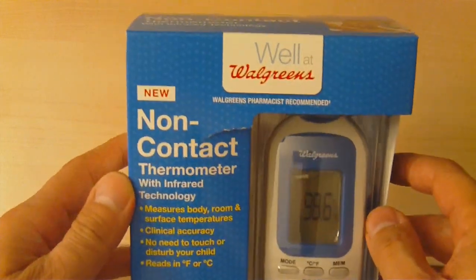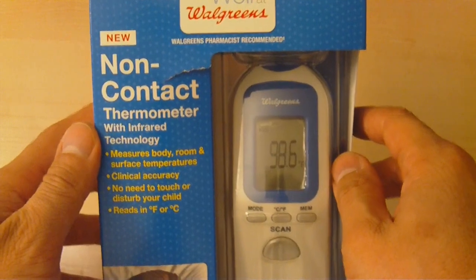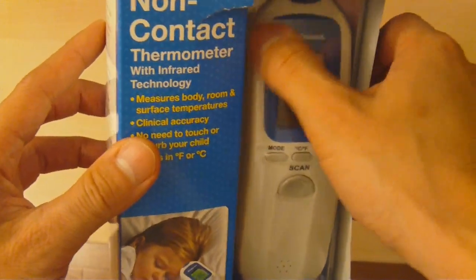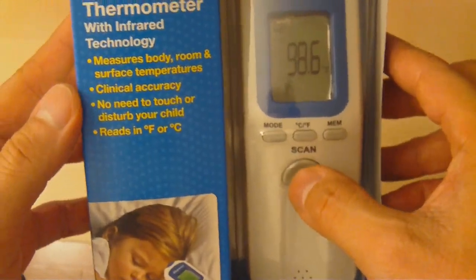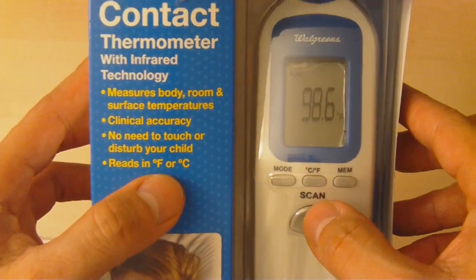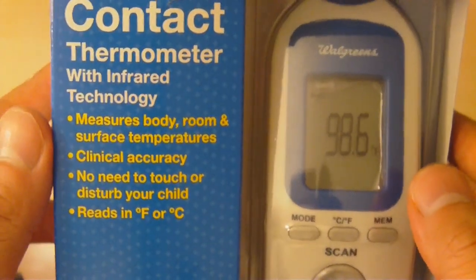This model is from Walgreens, but similar models — probably a rebranding — occur for similar items found at CVS pharmacy, for example. Everything is the same except it's rebranded as CVS. The thermometer has a digital display, buttons, and it says there's no need to touch or disturb your child. It reads both in Fahrenheit and centigrade, has clinical accuracy — which is very important — and it measures body, room, and surface temperatures.